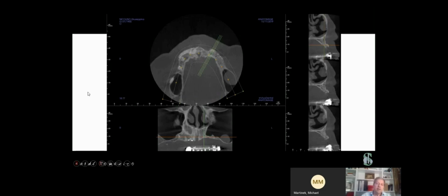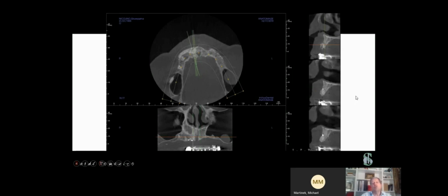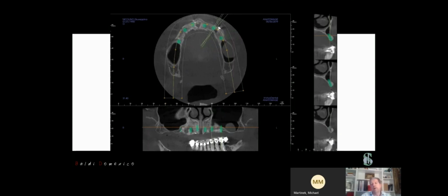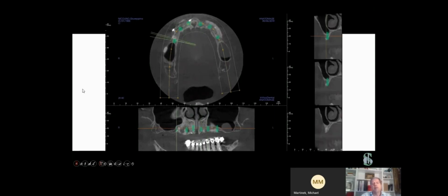Here you can see the CT of the same patient after the extraction and after the bone regeneration, the bone augmentation. And you can understand how it was possible to maintain the bone with an atraumatic extraction, and on the other side, like here, it was possible to have a good bone regeneration. And in this situation, it's possible to apply the same planning that we decided before. So after analyzing the situation, we can decide to place our implant. So we can plan our implant surgery, and you can see how it's possible to manage our planning without a problem.